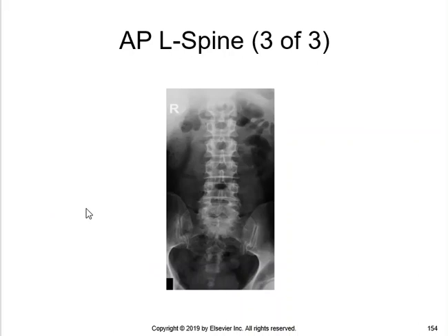Now, sooner or later, you're going to run into a test question that asks you about how to perform a frontal view of the L spine and make sure that the intervertebral disc spaces are more open, or what projection you can use to open up the disc space better. And I'm going to kind of draw it out here, but the L spine, even if you bend the patient's knees, you got a little bit of that lordotic curvature.